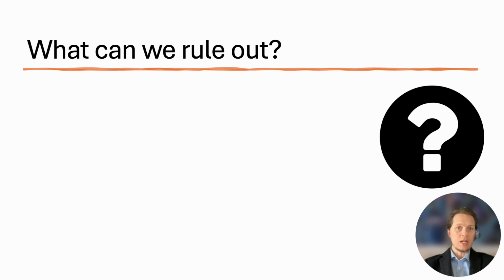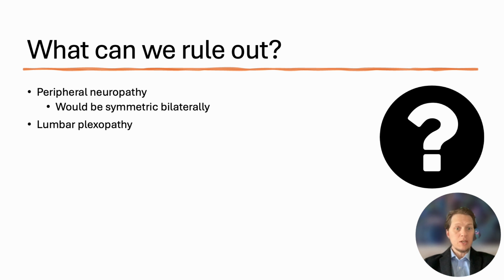So what are we thinking about? What can we rule out? Well, now peripheral neuropathy, that does not seem likely because it should be symmetric, of course. What if it's a plexopathy? Did anyone think of that? Why was I doing saphenous sensory? Whenever we get additional sensory values, maybe we are thinking maybe it's a case of potential plexopathy.